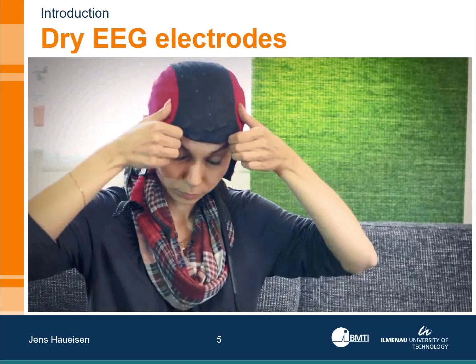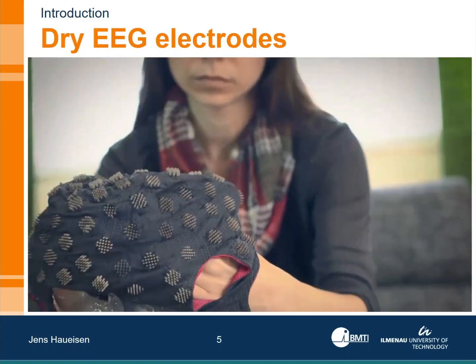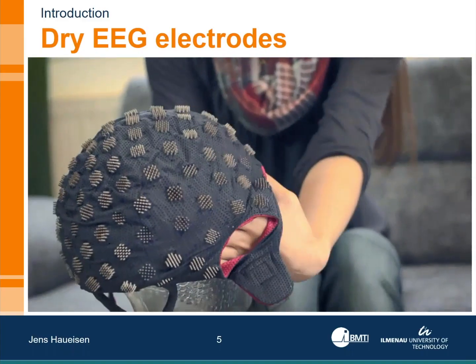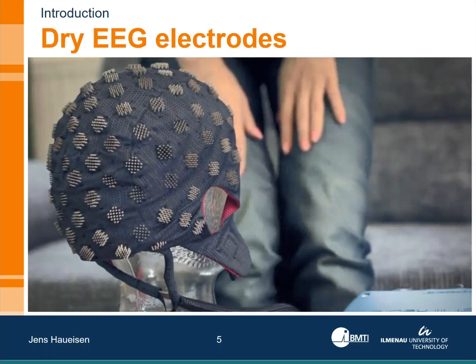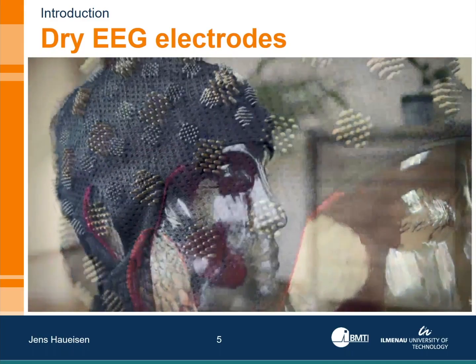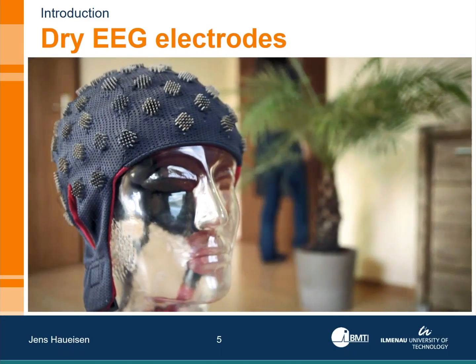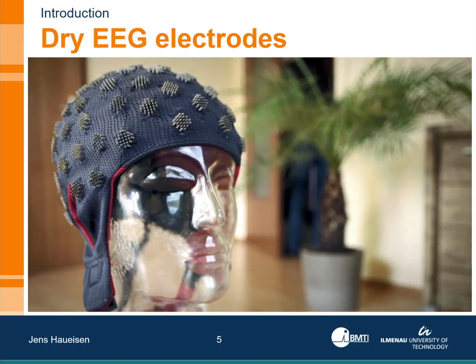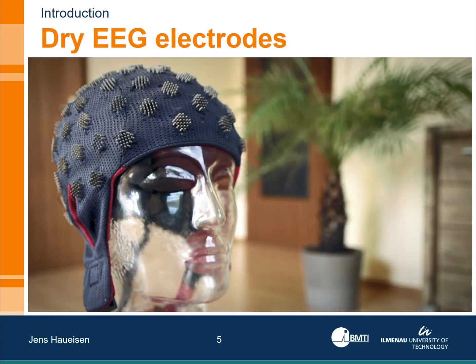Now, finally, when you observe the video now, at the end of recording, there is no hair washing. You just place the cap back, in this case on the glass head or wherever you like, and you go and do whatever you want. So this is the big advantage in terms of the dry electrode recording.